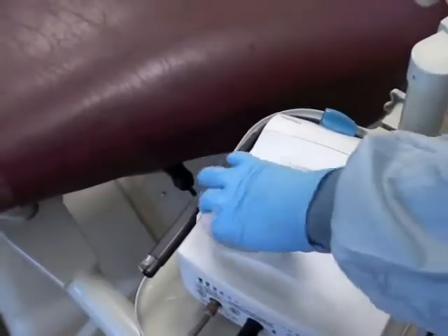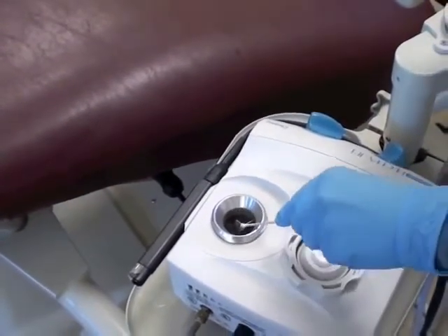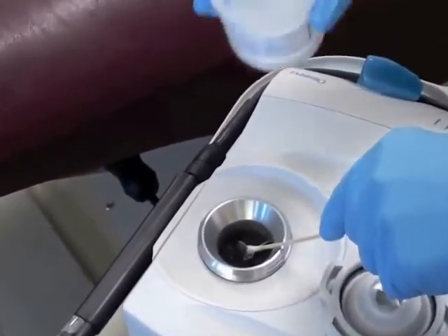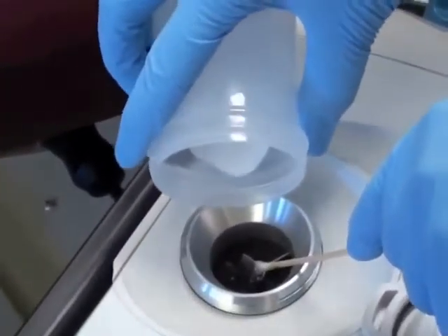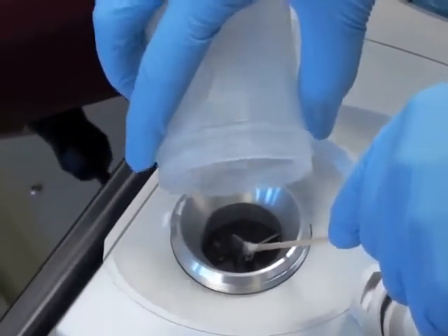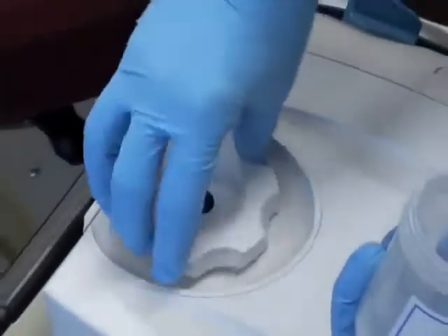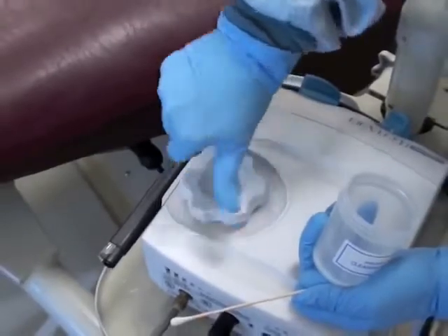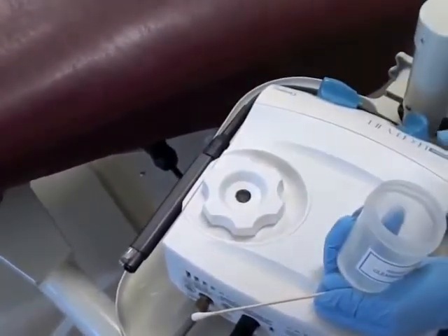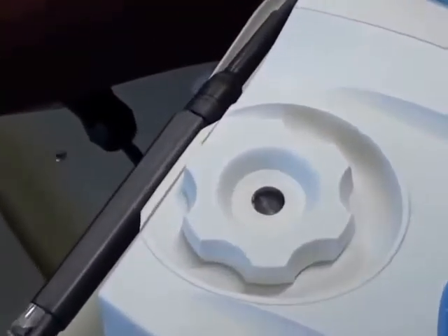I'm going to show you what happens at the beginning of the day. I'll take the top off of the powder chamber, and I always put my cotton swab over top of the hole, just because you don't want to get powder directly inside the hole. You just empty your powder in, put your top back on, and then turn your unit on to make sure that the powder fluffs, which you can clearly see in the window that it is.